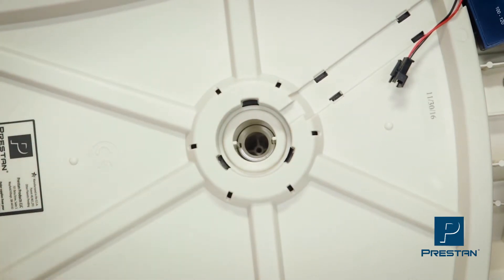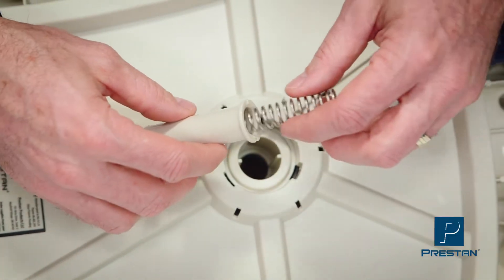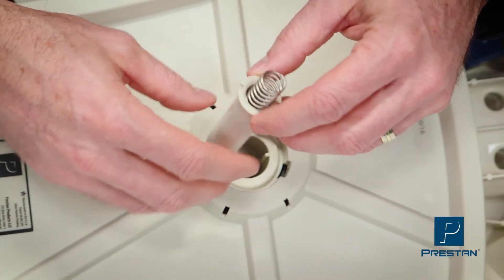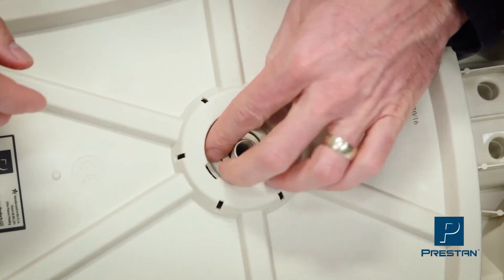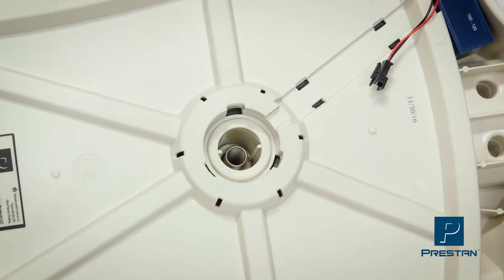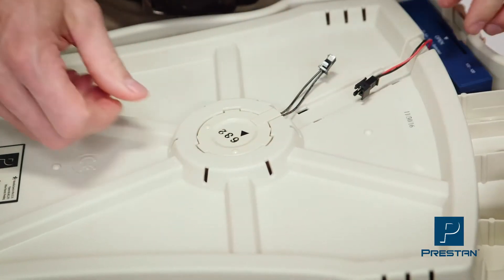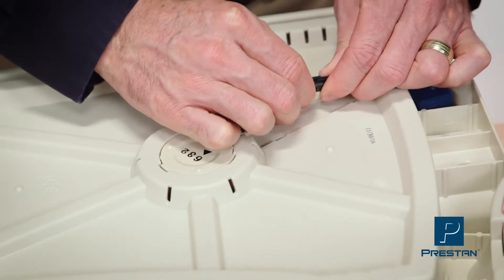With the new assembly, insert the small spring into the piston sleeve, then insert both into the mannequin, ensuring the spring is facing out and the slots are aligned. Snap the new clicker into place, reconnect the wires, and replace the wire cover.